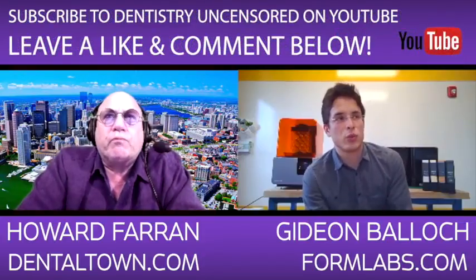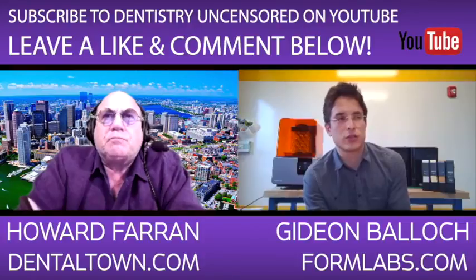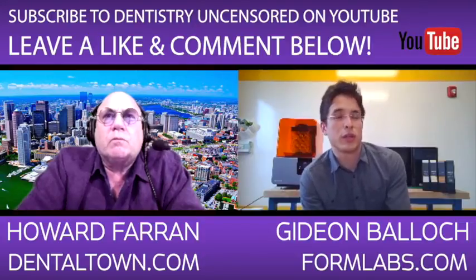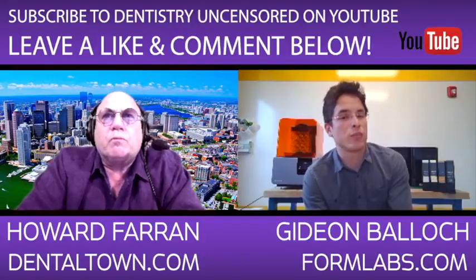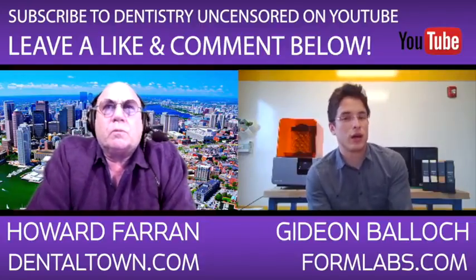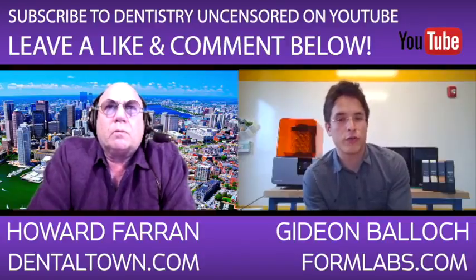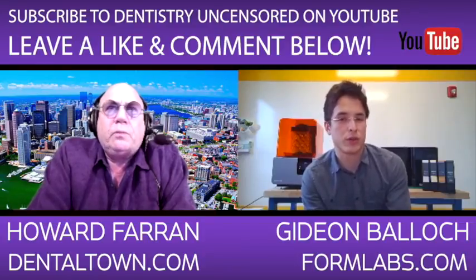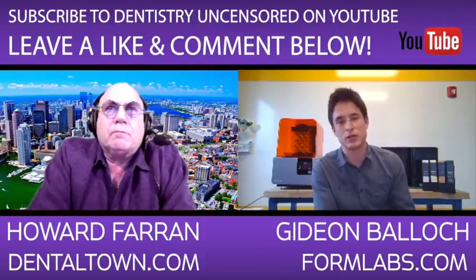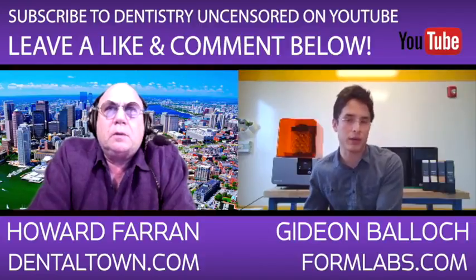So I think actually what you'll see isn't different classes of materials like gold coming into a desktop 3D printer any particular time soon. But what I think you will see is a lot of creativity from polymer scientists like the ones that we have here at Formlabs to try to take 3D printable stereolithography photopolymers and get the same sort of properties that you would expect out of a gold filling or another application in order to be able to direct print those. So the materials aren't exactly the names that you would expect, but because of the polymer science that goes into it, you're getting the same properties that you need.